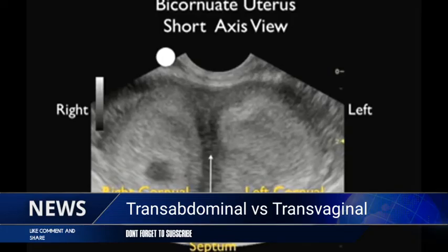Unfortunately, pregnancies within a bicornuate uterus can be problematic if the implantation is high within the cornual limb. This is considered a cornual ectopic pregnancy, a variant of ectopic pregnancy even within the uterus, defined by a thin endomyometrial mantle.